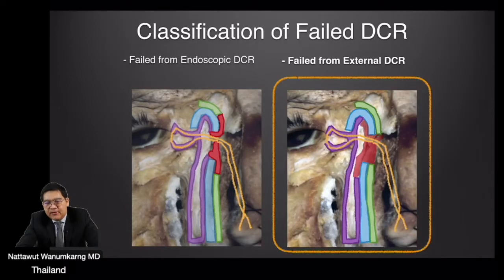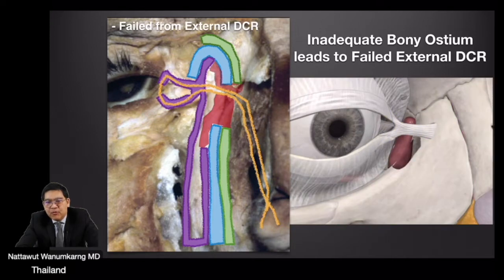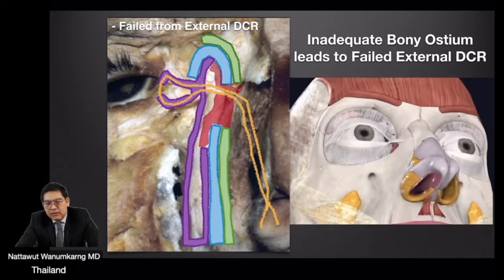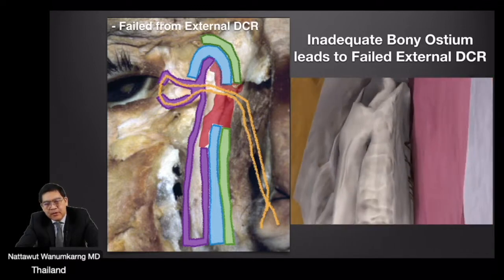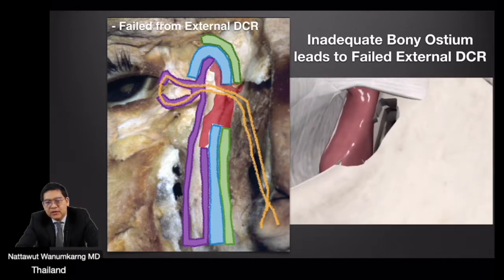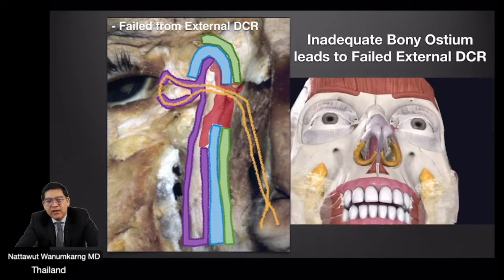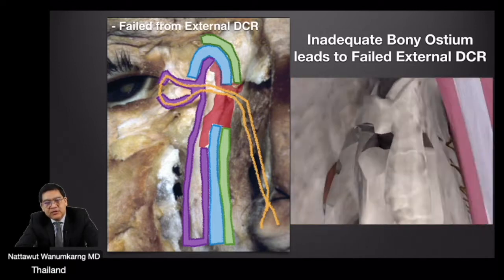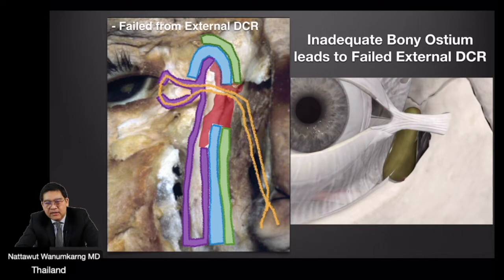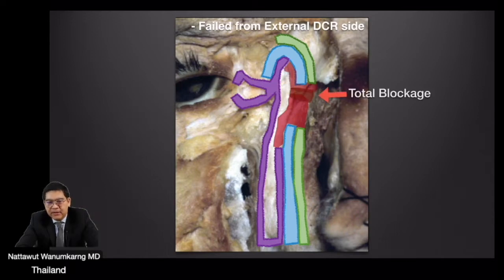The findings of failure from external DCR. In the video, the surgeon tries to remove the frontal process only in the lower two-thirds. By endoscopic view, the bony ostium is too small, and the surgeon tries to enlarge it. With the external approach, the limitation is that we cannot remove the bone underneath the medial canthal ligament, and if the bone is not removed adequately, it leads to failed external DCR. When we remove the silicone stent, total blockage happens.